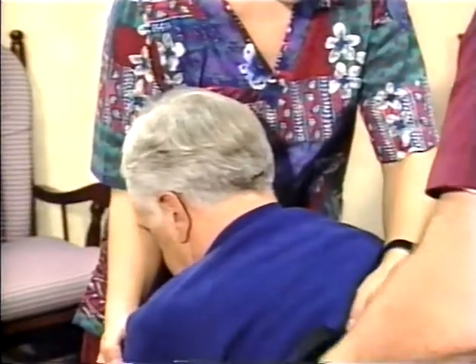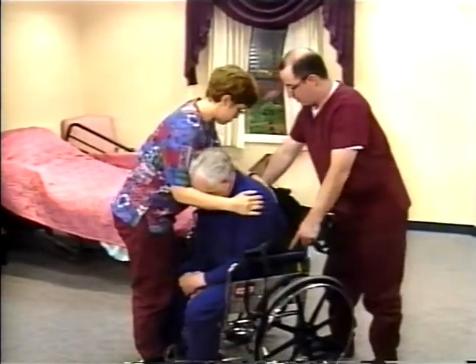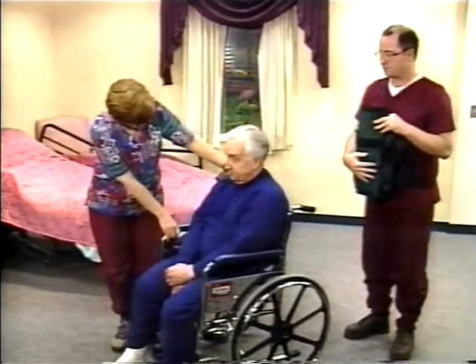help him lean forward. Place his arms on his knees for stability. You can also lean his head on your shoulder or chest if you prefer. Now, reach back and pull the sling from behind him. Be sure to help him reposition himself in the chair.